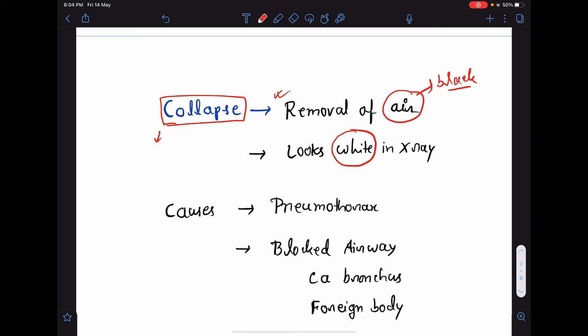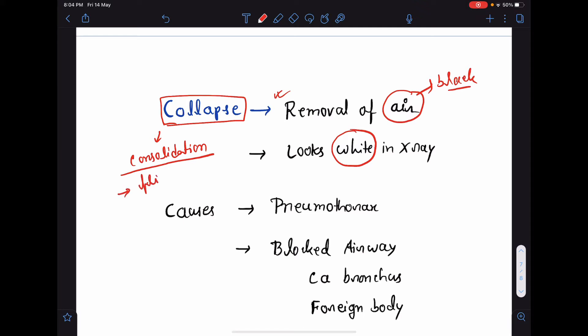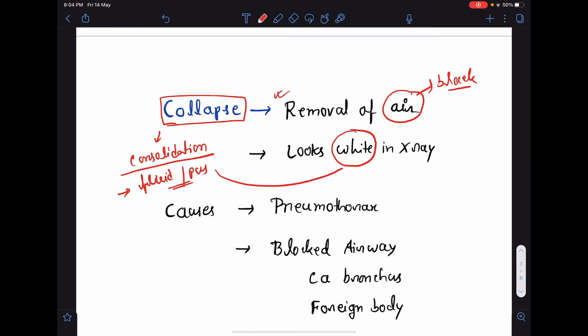At the same time, we should know about consolidation. What is consolidation? Consolidation means solidification of the lung tissue. It also means there is presence of fluid or pus in the alveoli. So, consolidation will also look white in a chest x-ray.